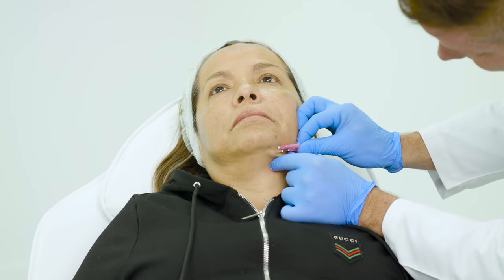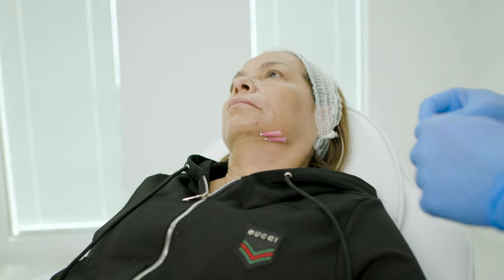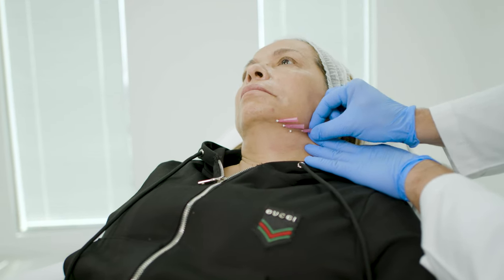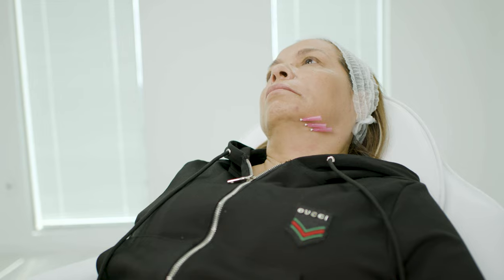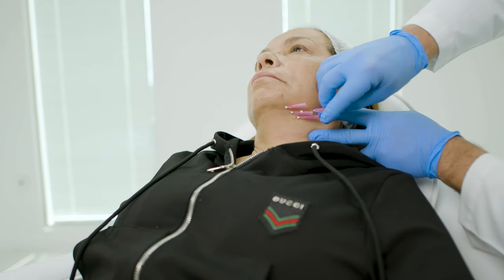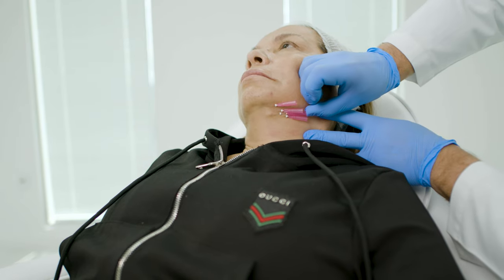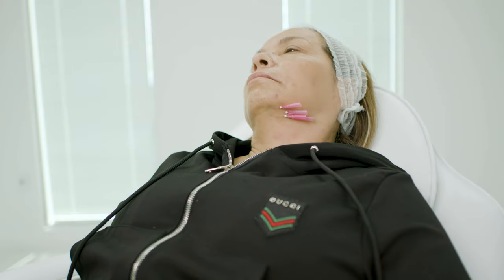You'll see that these go in pretty easily. They make pretty cool Instagram photos, so if your patients are into Instagram, go ahead and let them take a picture once you get them all in place. Our goal is just to place the threads in the submental region so that as they dissolve, they will tighten the skin and stimulate some collagen production. I typically place about 10 in this area for the first treatment — four on each side and then a couple from the front.